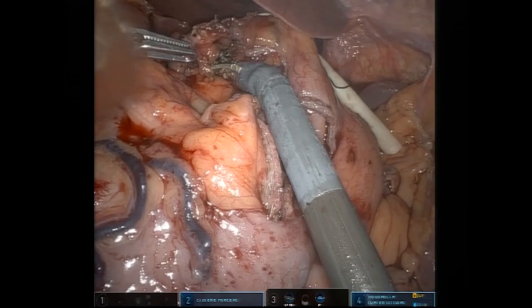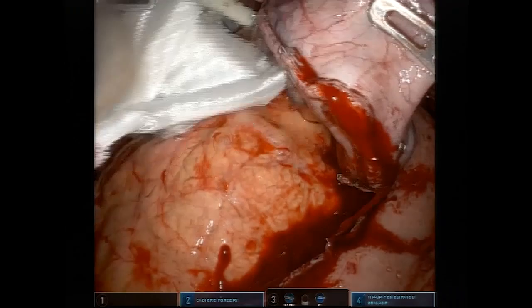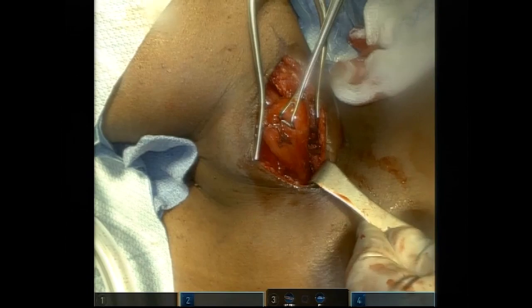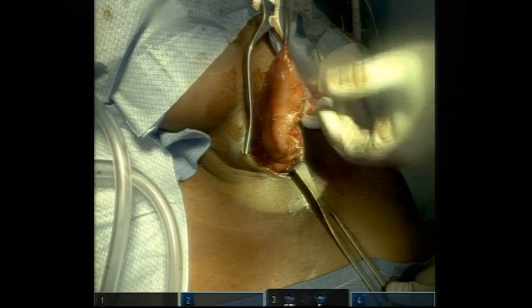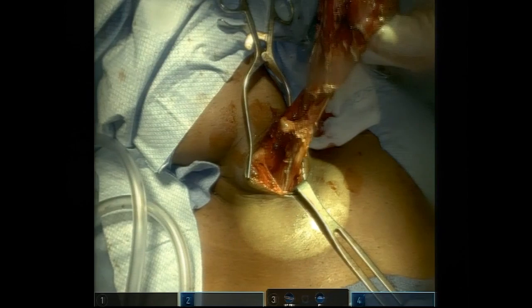Creation of the gastric conduit is completed and the excised lesser curvature is placed in a retrieval bag and removed from the abdomen. Using a left cervical incision, the cervical esophagus is mobilized. The gastric conduit is then pulled up into the cervical wound. It should pull up without tension, and orientation should be maintained.